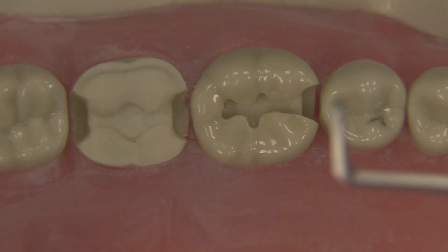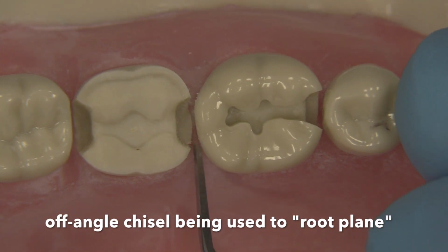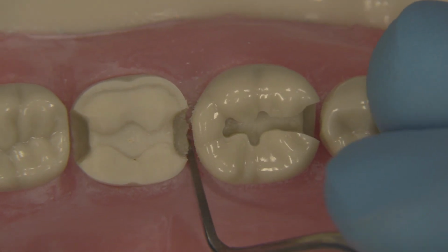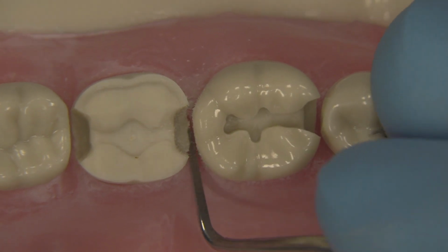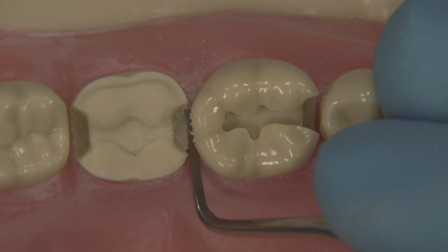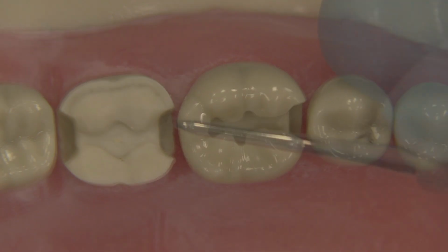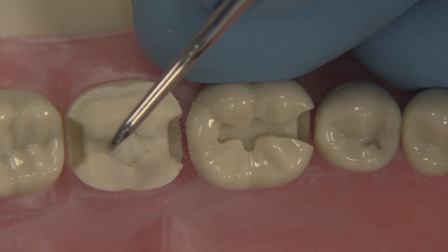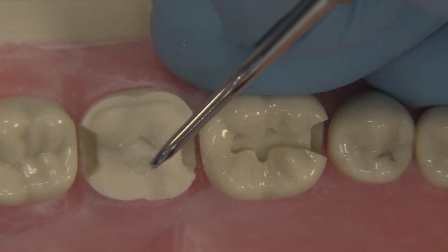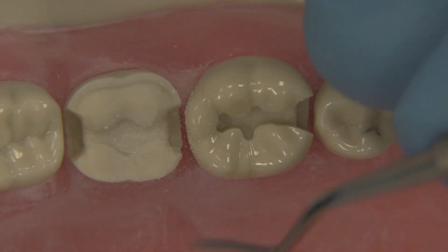So you can take the instrument, this is what I was doing before. You can take the instrument sideways like this and use the bevel towards the wall and slice up like a root planing instrument. Now you have to have some practice doing this, but you're reshaping the tooth from below. And you can even do this clinically. But you see how that just made it a lot more uniform, that one little move. Now you can use your off-angle chisels, the 42S, the best one, to smooth the rough areas. You can use the gingival margin trimmer.